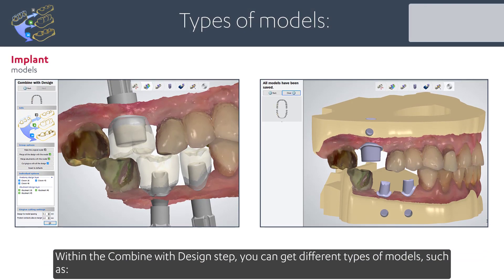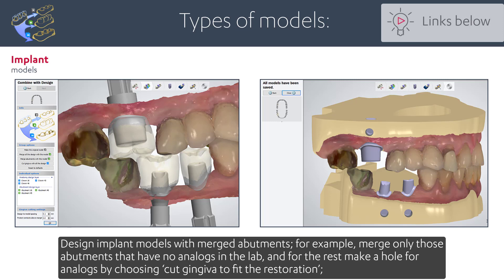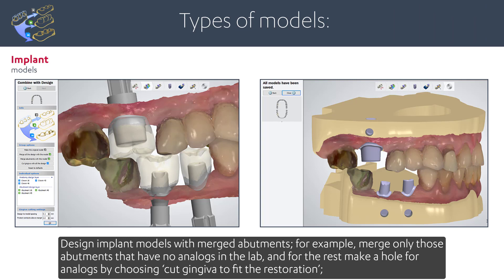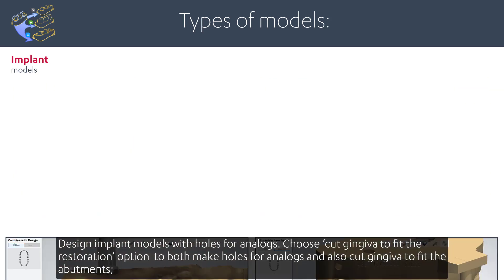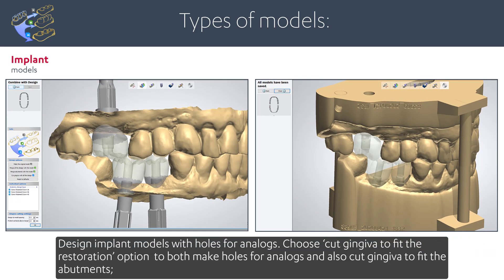Within the combine with design step, you can get different types of models, such as design implant models with merged abutments — for example, merging only those abutments that have no analogues in the lab, and for the rest, making a hole for analogues by choosing 'Cut Gingiva to Fit the Restoration.' You can also design implant models with holes for analogues by choosing the cut gingiva option to both make holes for analogues and cut gingiva to fit the abutments.